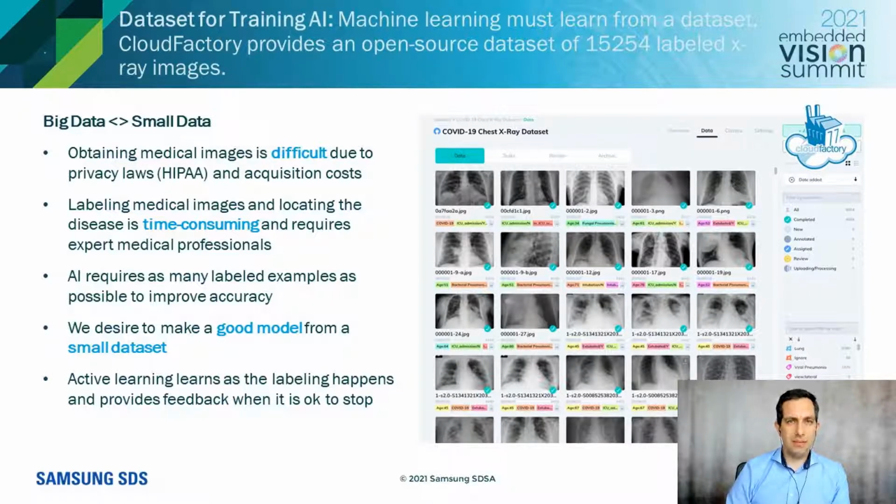And so 15,000 images had to be opened by an expert doctor and labeled. In fact, every image has been labeled by 6 different doctors. So 15,000 images were each labeled 6 times in order to get a democracy kind of voting regime on which image is which class. And so it's really quite costly to come up with a labeled data set like that. And so an associated question is, can we get away with using less data?